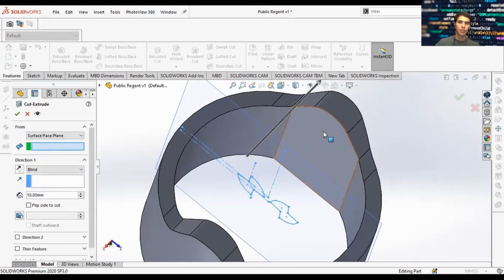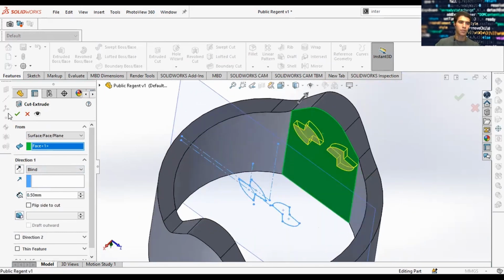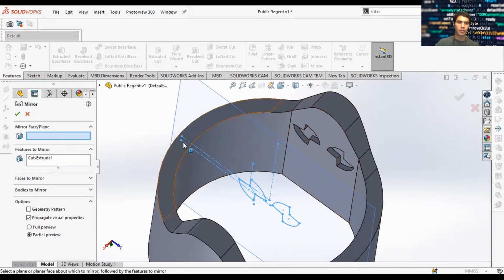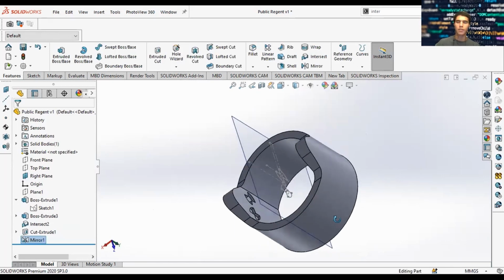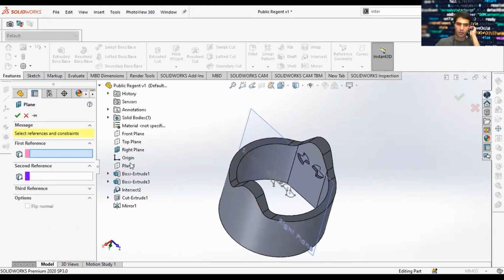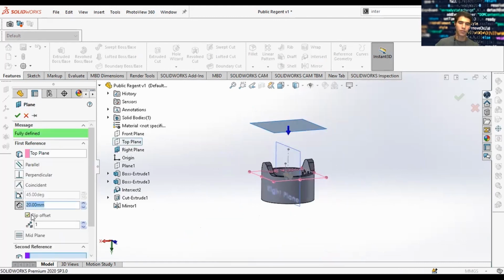Go ahead. Try to just extrude surface. That's good. Extrude that and mirror the feature across the right plane. And let's check that it's there. It's there. Cool. So now we can hide our right plane for now. And actually what we'll do is we'll add a new plane. Add a new plane to the top plane on the opposite side. So offset.